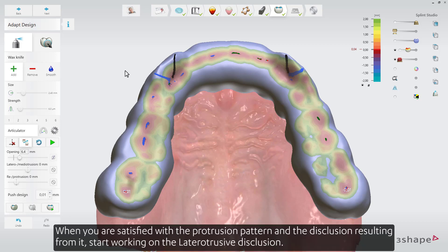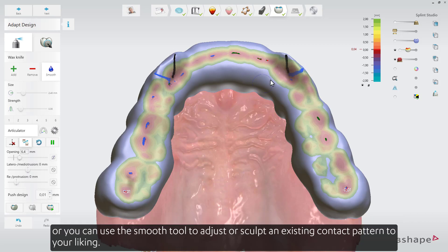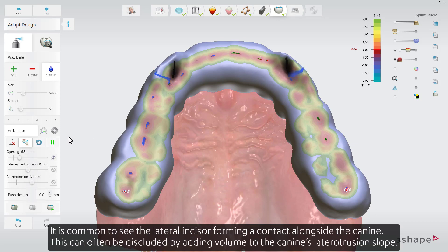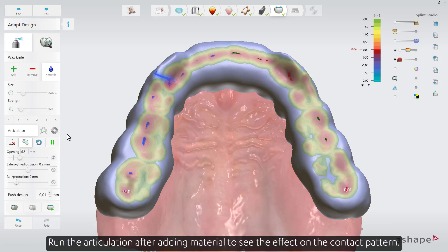When satisfied with the protrusion pattern and the disclusion resulting from it, start working on the laterotrusive disclusion. To refine the canine guidance in lateral protrusion, depending on the case, you'll need to either add material gently to the laterotrusive slopes bilaterally until the desired contact pattern is achieved, or use the smooth tool to adjust or sculpt an existing contact pattern. It is common to see the lateral incisor forming a contact alongside the canine — this can often be discluded by adding volume to the canine's laterotrusive slope. The wear, position, and buccolingual inclination of the canines directly affect the dynamic contact patterns. Run articulation after adding material to see the effect.